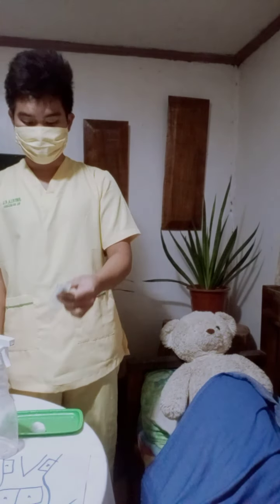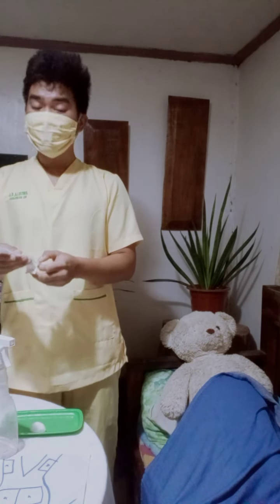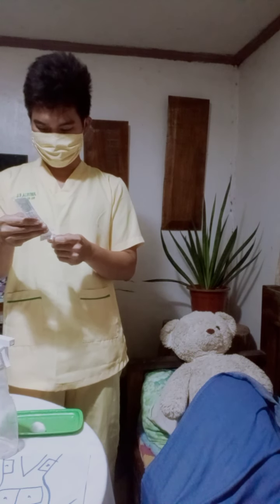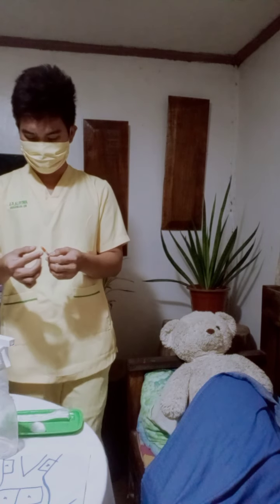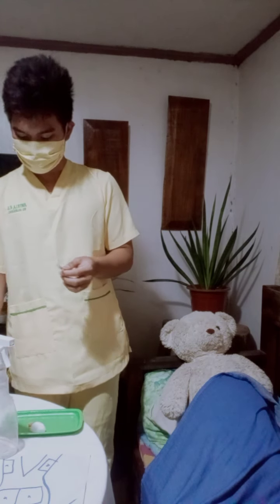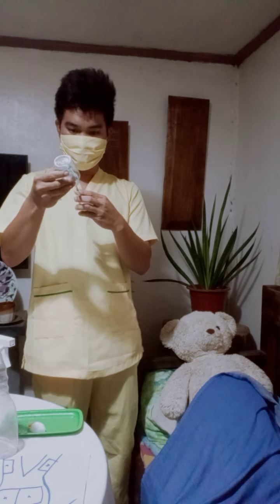Next to that, we're going to pull the plunger. We're going to open it first. Pull the plunger to the desired dose that we're going to use. After that, we're going to inject it to this vial. Inject it to the vial.